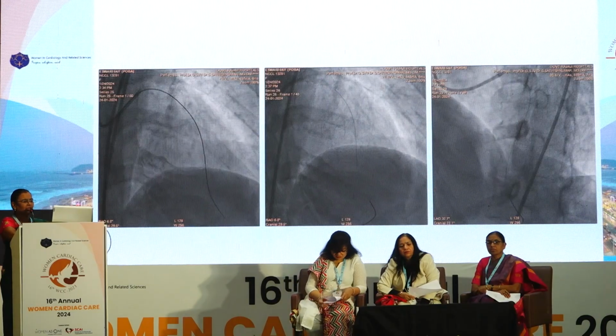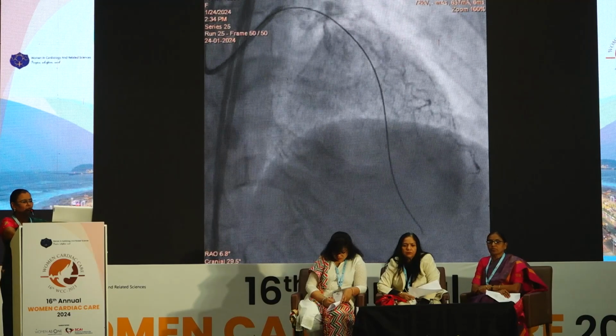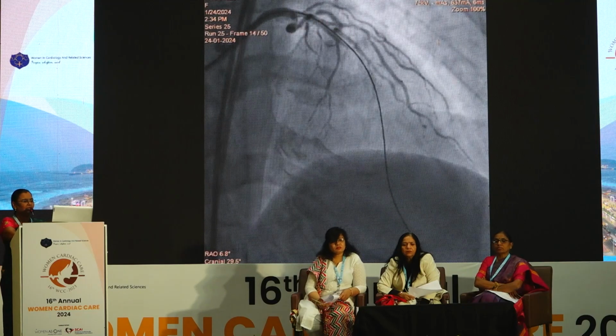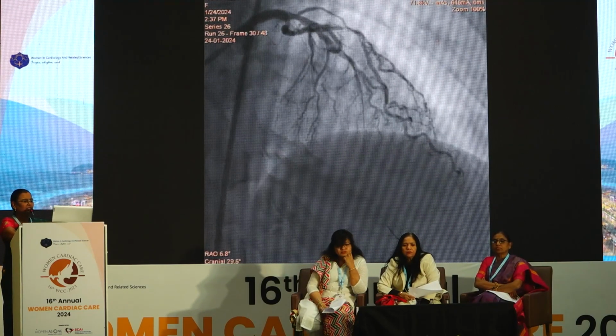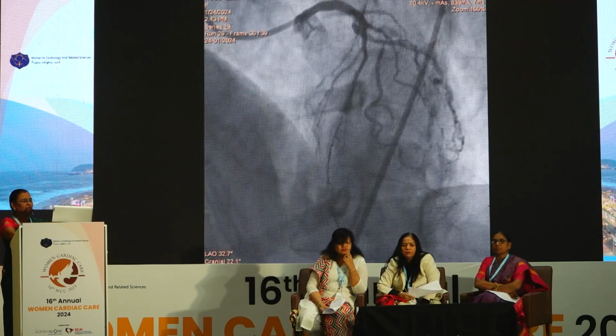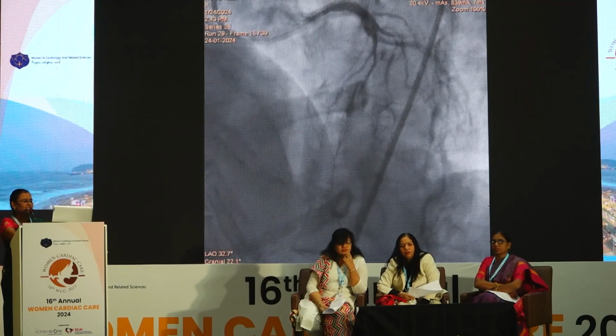Then we proceeded with the balloon dilatation, 1.5 balloon only. After seeing the distal artery, which is less than 2 millimeters, it is not fit for stenting. So this is the final angiographic picture with wire and without wire, LAO cranial view. So we deferred stenting.